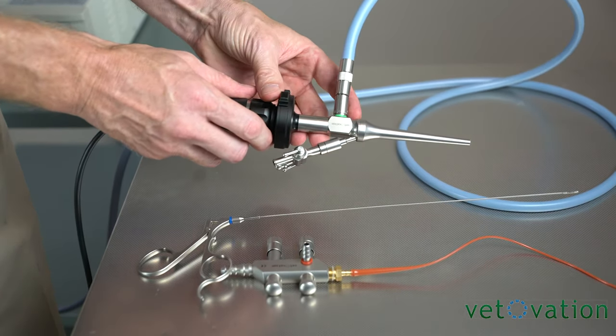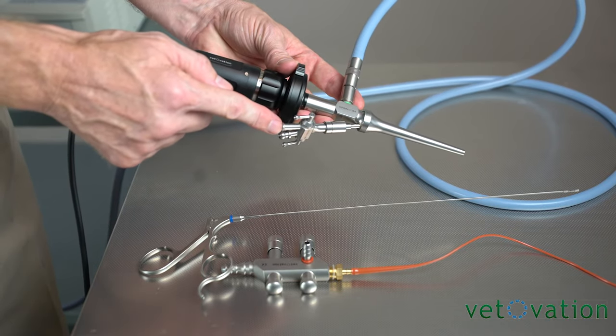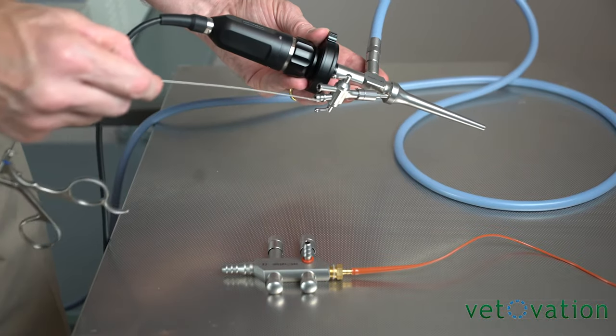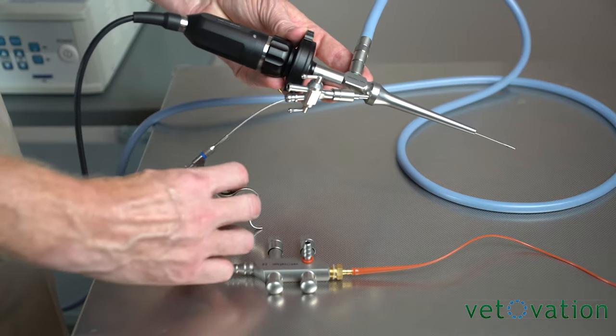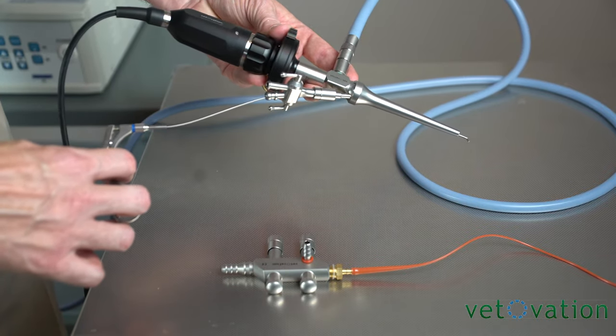Now you have a video otoscope that has a working channel. You can attach a standard IV bag to this side to be able to flush and run fluids into the ear or you can attach an instrument that you can now remove wax, hair or take a biopsy.